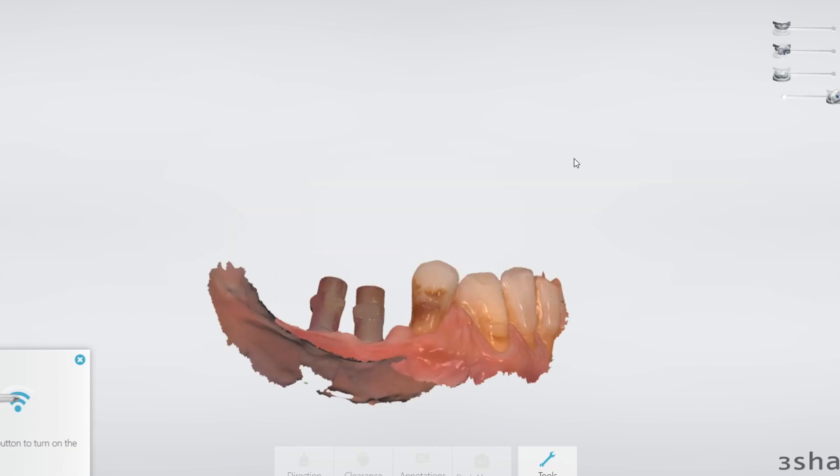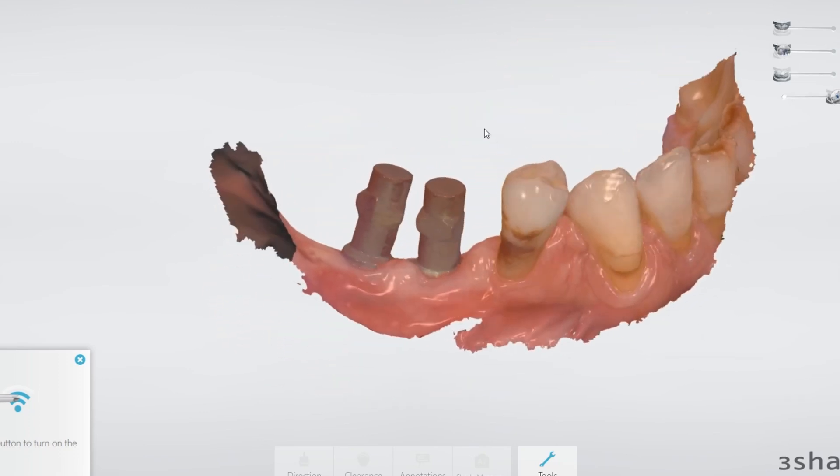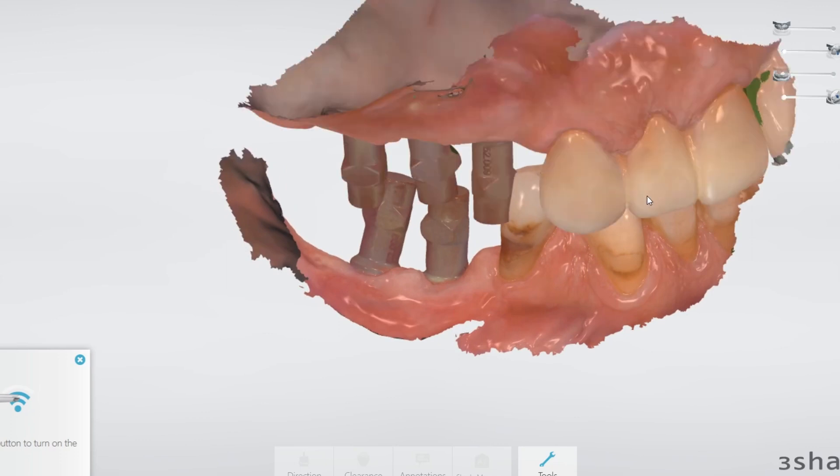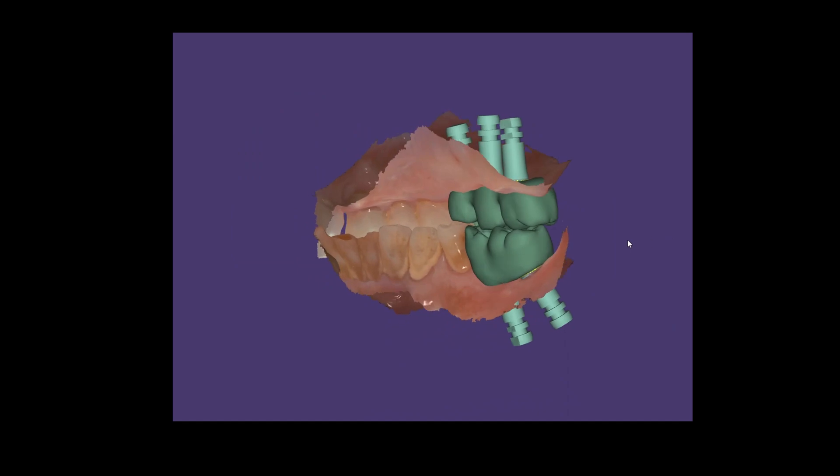I do intraoral scan flags — I don't do PVS impressions. And then I'm going to send this off to my designer and he's going to design the actual parts: the quad one and quad four bridges.